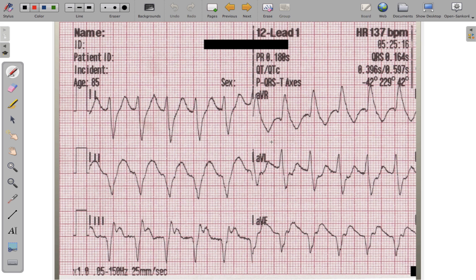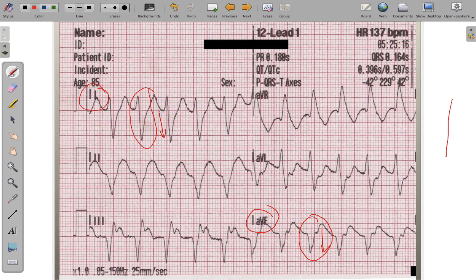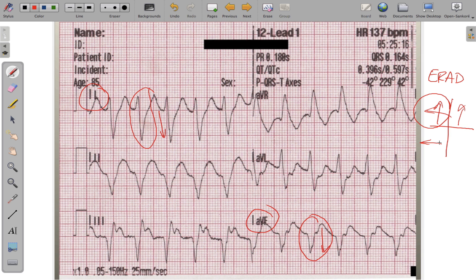In the final example, both lead 1 and lead AVF show wide, negatively oriented QRS complexes. For both to be negative, the vector must be traveling upward and to the right — into the extreme right-axis deviation quadrant. The EKG confirms with a calculated axis of 229°, right on target for extreme right-axis deviation.